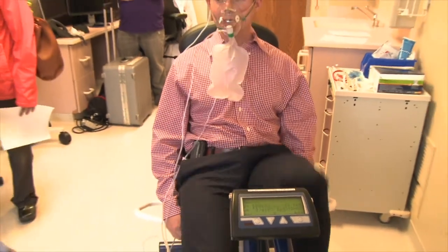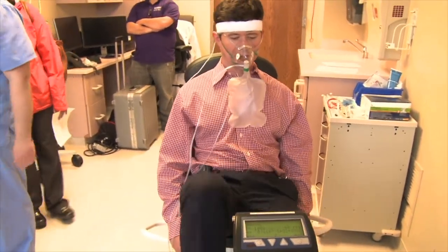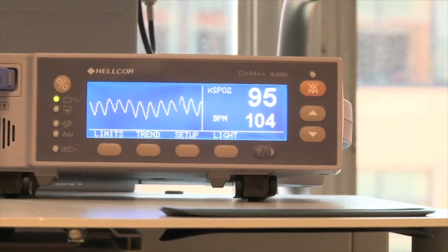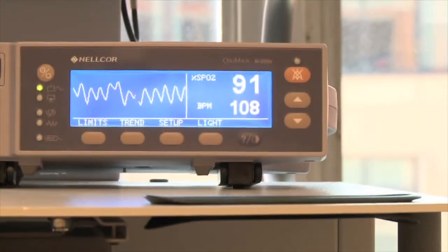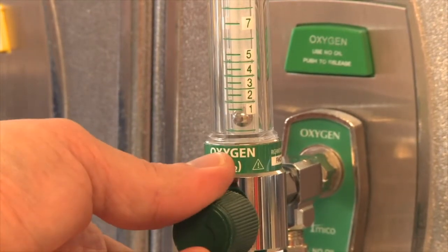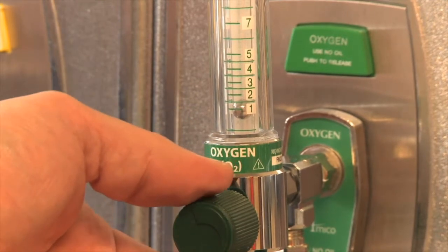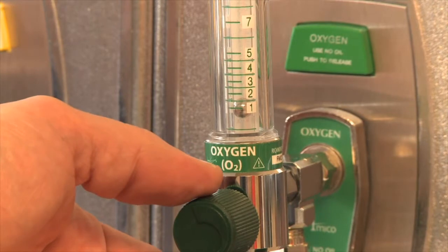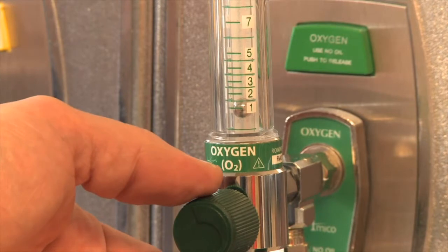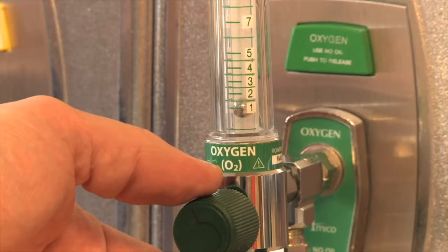To perform exercise testing, the patient should be walking on a treadmill or pedaling on a bicycle ergometer with minimal resistance while continuously monitoring their heart rate and SpO2. The purpose of this is to simulate the patient walking around the cabin during flight to make sure they do not become symptomatic. Oxygen should be titrated by 1 liter a minute to keep the SpO2 greater than 88%. If the patient requires oxygen to do this, then they should be prescribed that amount of oxygen for air travel. If they do not require oxygen to keep the SpO2 greater than 88%, then they do not require oxygen for travel.